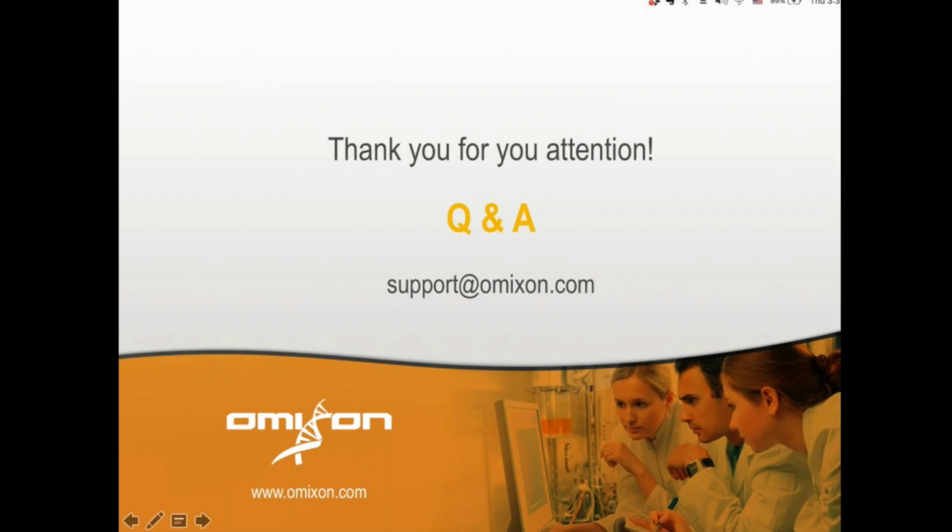I can see one question. We have a data integrity issue, so do we need a server to connect to you for support? Well, actually, we don't need to access your server. If you can connect us with some application like Skype, GoToMeeting or WebEx to see actually what you are doing online, it's more than welcome. And if not, we can support you, for example, on phone, or if needed, we can even come on site to give you troubleshooting.